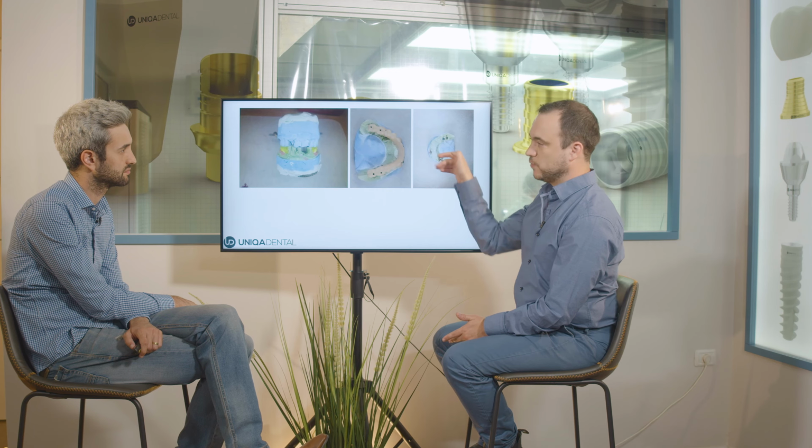We took out the teeth and made a temporary bridge on those implants, as if we had extracted the teeth. We just cut the teeth from the model, scanned the model in a laboratory scanner that we had in those days, and made a temporary bridge on those 5 implants. And you took into consideration the extraction of the frontal teeth? Yes, I took all the teeth from the model and made the bridge as if we didn't have any teeth in the frontal area. In this case, we already solved the aesthetic issue.